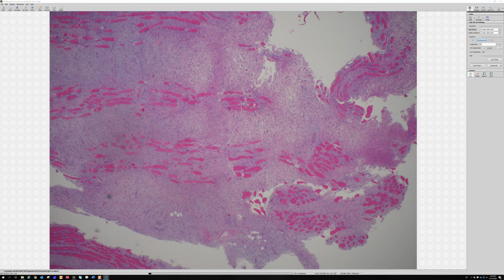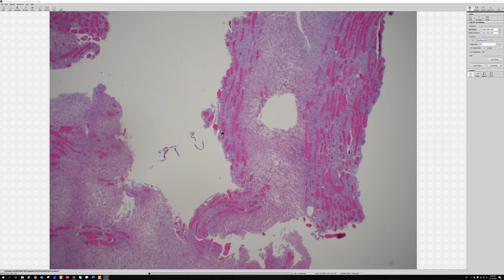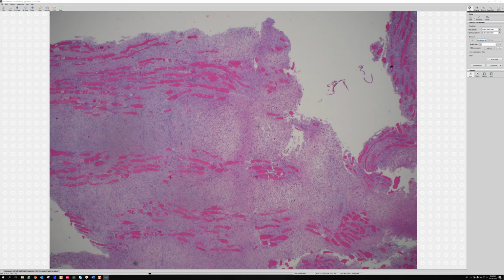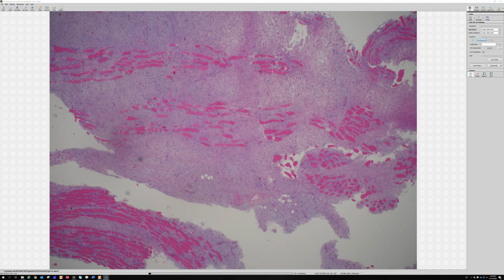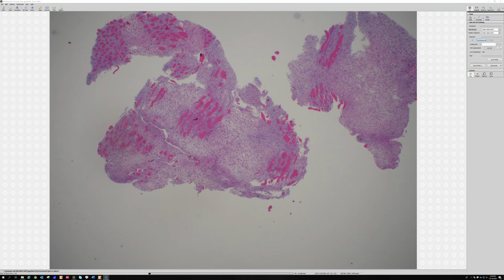The other thing that helps is this is the whole lesion. There is no central mass. Like most sarcomas, even if they infiltrate, they'll have a central area that's tumor, definitely, and then at the edges, they'll trickle out like a myxofibrosarcoma. But here, there is no center, right? The whole thing is like a patchy quilt of weird splayed apart muscle and fasciitis, and weird muscle and fasciitis all patched together. Some people call this a checkerboard pattern, and the way the muscle splays apart from low power is super helpful.